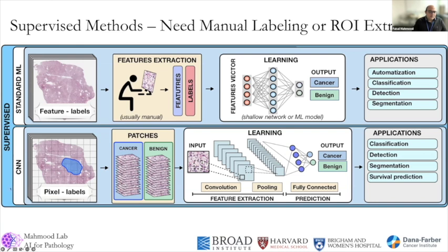About 6-7 years ago, when convolutional neural networks became very common, a common approach has been that someone goes in and annotates the whole slide image, and based on that annotation, we would say, okay, this region is morphology X, and everything else is morphology Y, and can we classify them? And we used a deep neural network, which does not require us to manually handcraft or engineer any of the features. An issue with this approach is that it requires these manual annotations, which can be slow and difficult to obtain, and requires expert annotation.